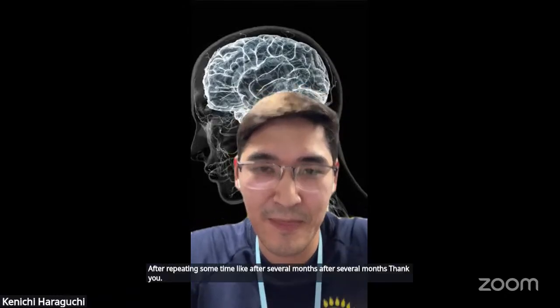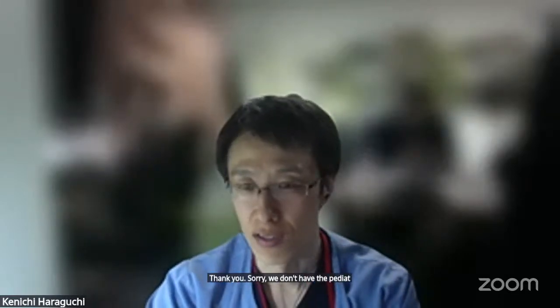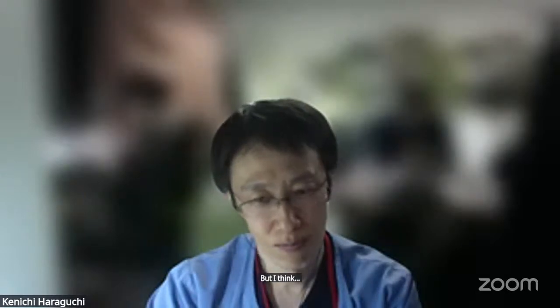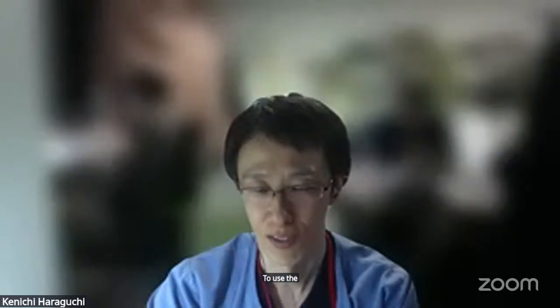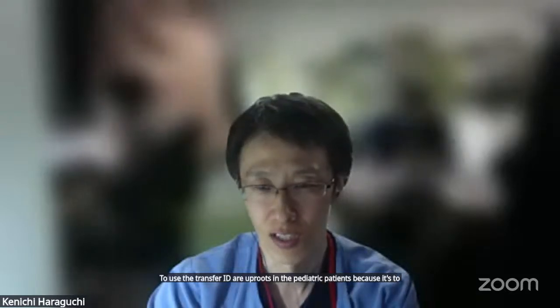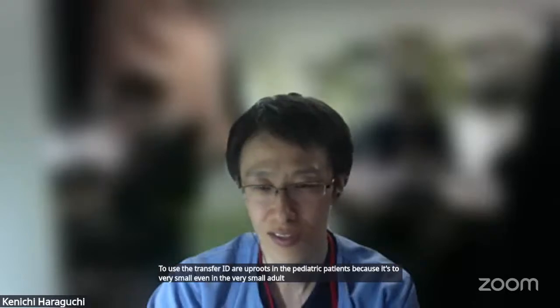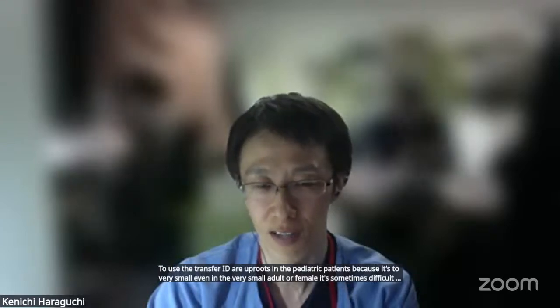Thank you. Sorry, we don't have a pediatric case yet, but I think it's very difficult to use the transradial approach in pediatric patients because the artery is very small. Even in adults or females, it's sometimes difficult to sense the radial artery.